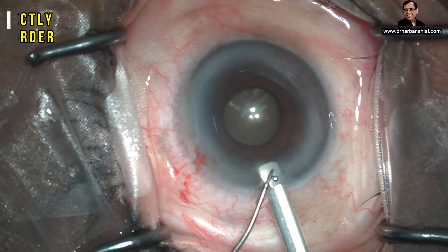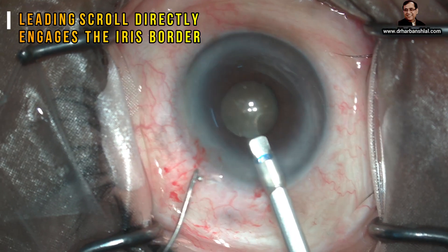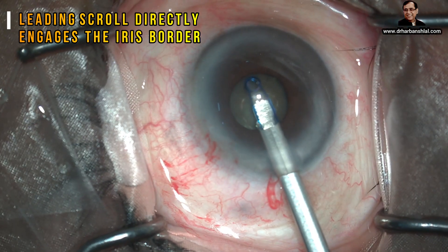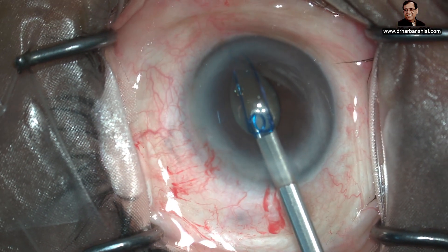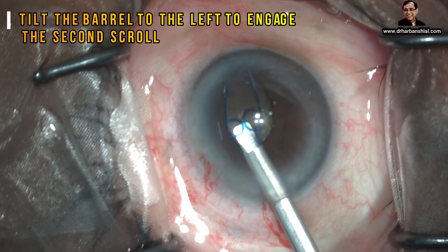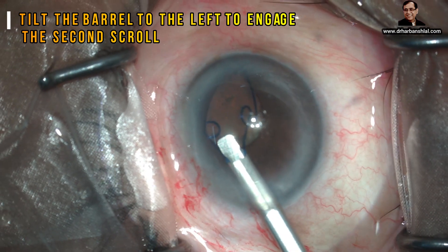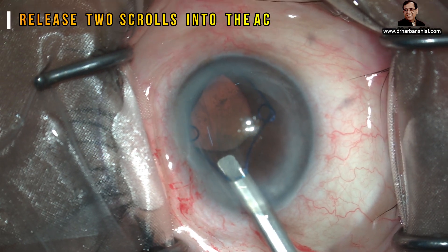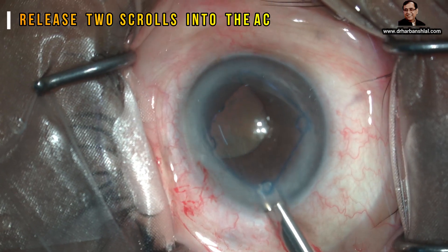Now put the barrel inside the eye. Push the plunger and the leading scroll directly engages the iris border. Now turn the barrel slightly towards the left to engage the left iris border. Two of them can be engaged while injecting, and the rest of the two are injected into the anterior chamber without making an attempt to engage the iris.